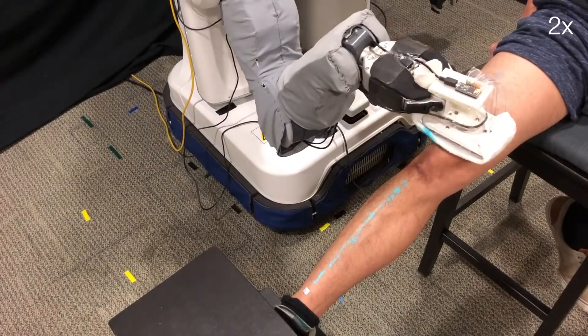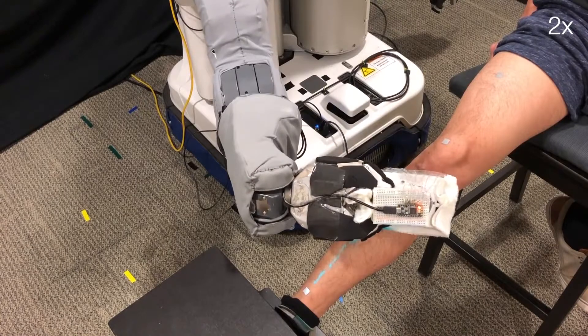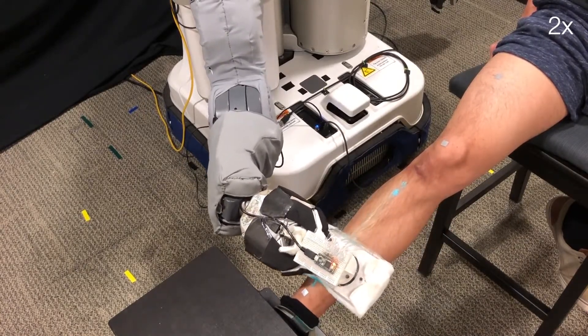However, due to decreased sensitivity with a wet washcloth, our approach doesn't always work and will occasionally lose track of a participant's leg and miss part of the surface while cleaning.